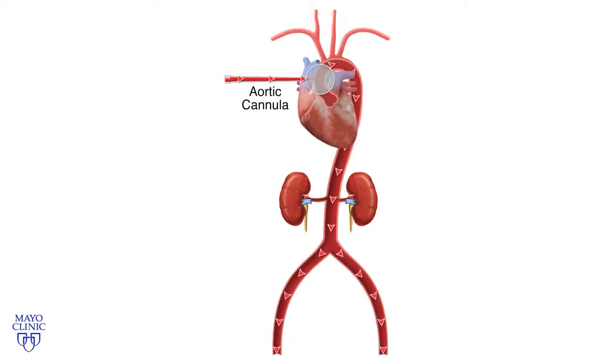However, as the heart recovers and begins to beat, the aortic valve opens and blood flow from the native circulation now mixes with blood exiting the centrally placed arterial cannula. The composition of the blood distal to that mixing cloud will depend on the relative outputs of each of the two circulatory systems. In this scenario, blood sampled from most regions of the body would generally have a similar composition.